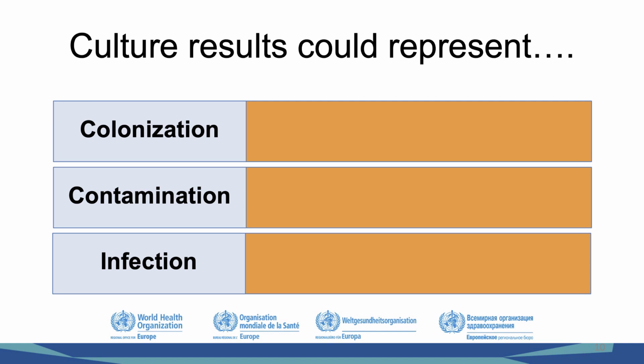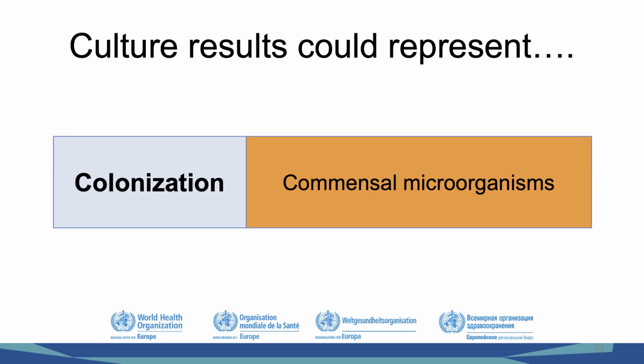Differentiating between colonization, contamination, and a clinically relevant culture result requires a careful assessment of the clinical situation, an understanding of how the specimen was obtained, and an appreciation of what microbes would naturally be expected to be found in or on particular body sites. Let's review broad definitions of each of these scenarios.